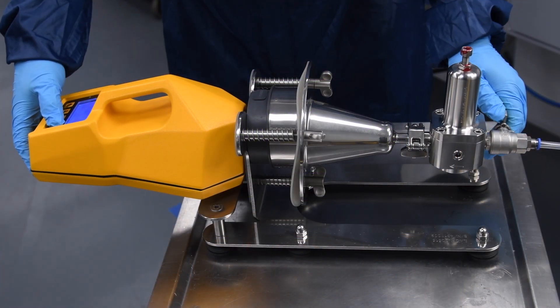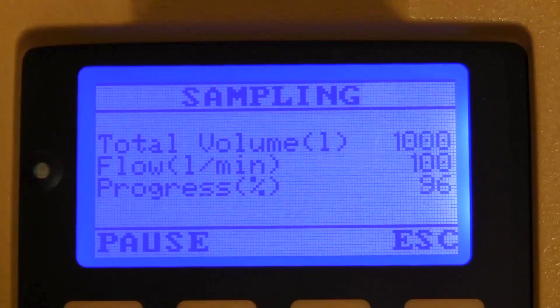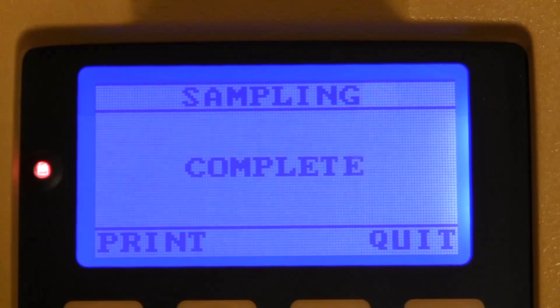Open the gas valve while pressing GO on the instrument. A signal will alert when the sampling process is completed and the programmed volume is reached.